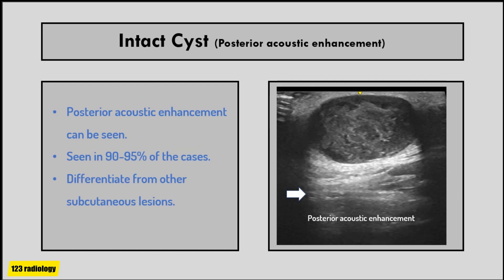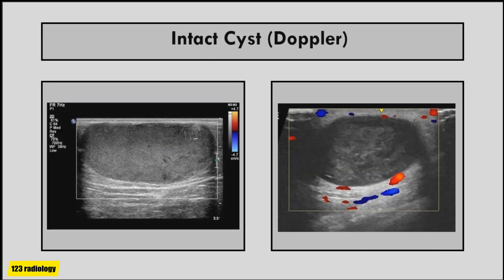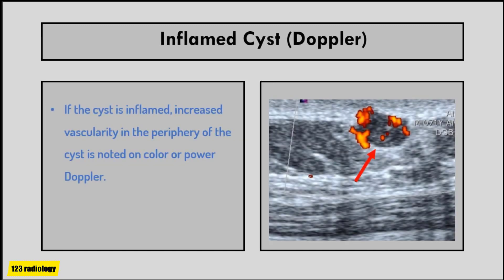Posterior acoustic enhancement is seen in approximately 90 to 95 percent of cases of epidermal inclusion cysts. This is an important characteristic which enables us to differentiate them from other subcutaneous lesions. A noticeable characteristic is that the cyst can communicate with the skin surface through a keratin-filled orifice, the so-called punctum. On color Doppler examination, most cases show no evidence of internal vascularity. If the cyst gets infected, increased vascularity is observed in the periphery of the cyst.